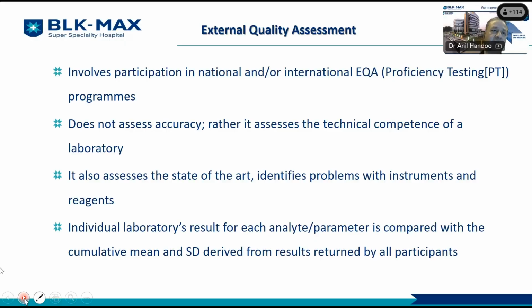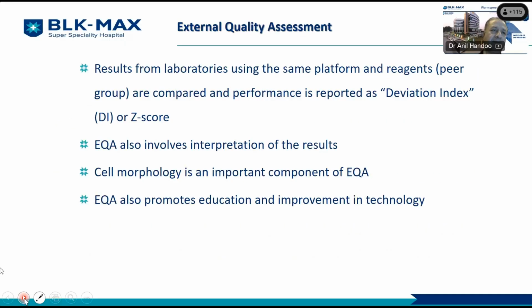You must also remember that this cannot be picked up from a usual precision study, because your controls are coming from the same vendor and you're not able to get hold of the differentiation in terms of bias, though some degree of it can be picked up.